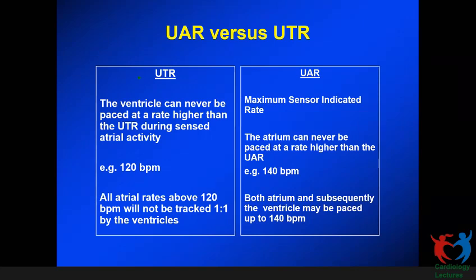So there are people for whom at least the single chamber timing cycles they're very comfortable with, and it is important to cover dual chamber timing cycles with them. There are other people who are in the beginning of their career, and there it's important to emphasize the single chamber timing cycle. So I think Govind did a good job of balancing everything, and he covered a lot of very clinical points also. We can probably re-emphasize that as we discuss some questions, if there are questions. But don't think you have to follow everything that was said.